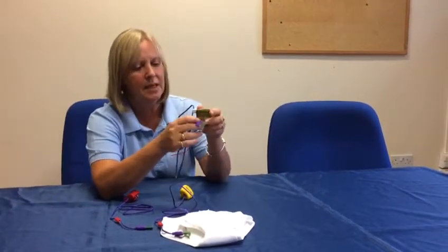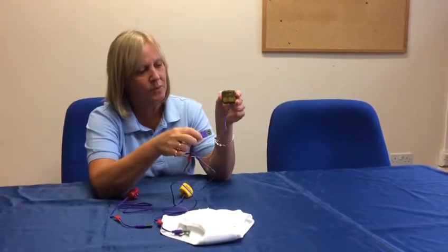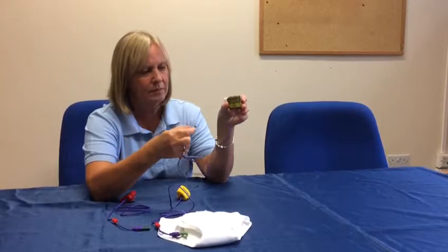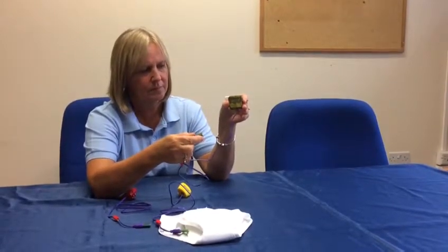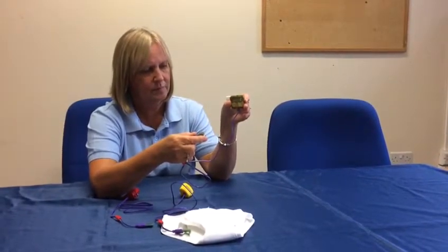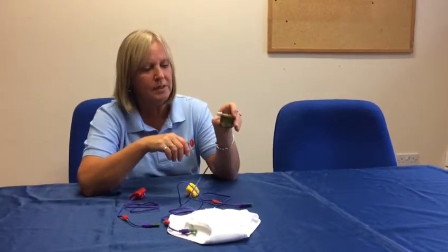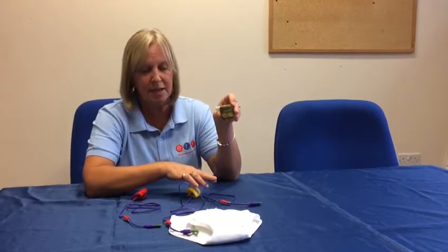The next alarm is the camouflage alarm, and this also has eight different sounds. These alarms are reasonably priced and they are the smallest alarm because they haven't got a vibration unit inside.